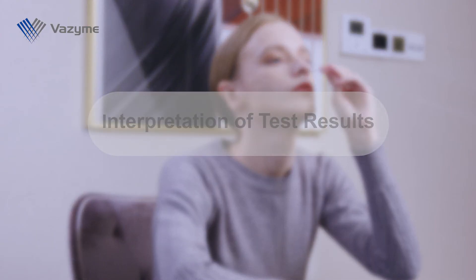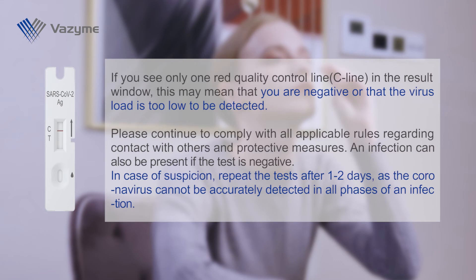Interpretation of test results. If you see only one red quality control line (C line) in the result window, this may mean that you are negative or that the virus load is too low to be detected. Please continue to comply with all applicable rules regarding contact with others and protective measures. An infection can also be present if the test is negative. In case of suspicion, repeat the test after one to two days, as the coronavirus cannot be accurately detected in all phases of an infection.